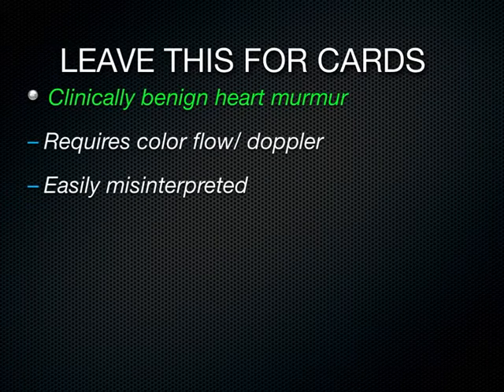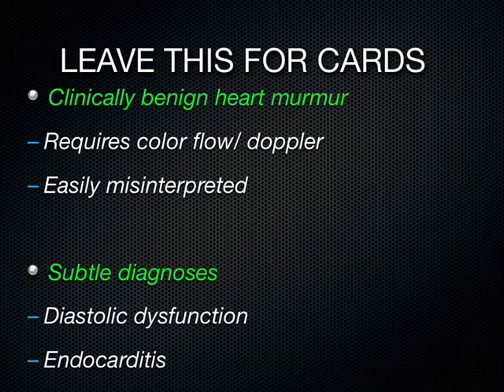But there's stuff we're going to leave to cardiologists, like the heart murmur. You come out of the room and go, hey, the patient's got a heart murmur, want to go look at it? Yeah, I'm sort of curious, as any doctor would be, to look at the heart and see what the murmur looks like. But really, to differentiate how much TR, MR, 1+, 2+, those things have no clinical bearing for me as an emergency physician, and it's easy to misinterpret those kinds of color flows across the valves. Other things like early diastolic dysfunction and endocarditis, I've hallucinated hundreds of times now. Just stay away from that stuff unless it's super obvious.